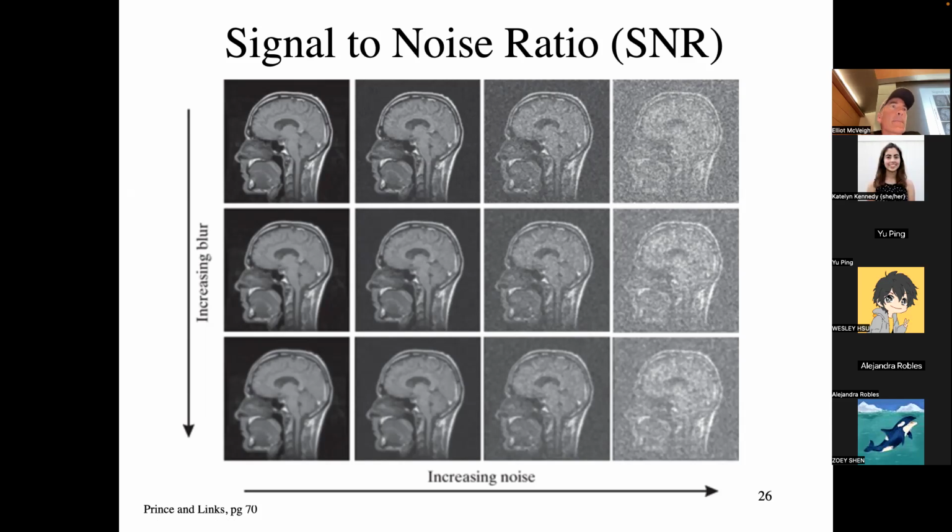Is the blurring decreasing the noise, because you're not adding any more signal to it? Correct. If I'm a pixel sitting here, the pixels around me have random signal on them from the noise process. If I average a group of them together, the amount of noise goes down, but the true dimension of my pixel has gone up.